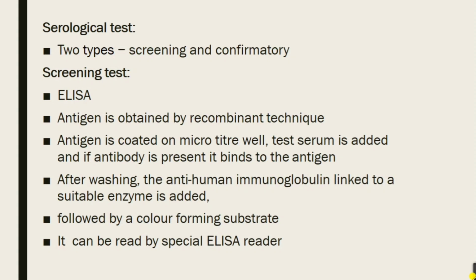The test serum is added, and if there is any antibody present, it will bind to the antigen to form an antigen antibody complex.